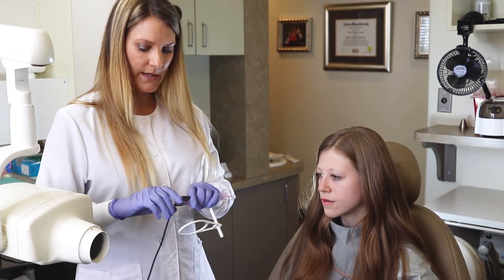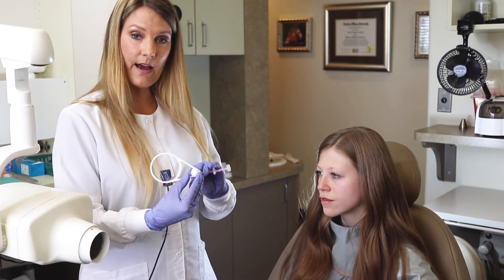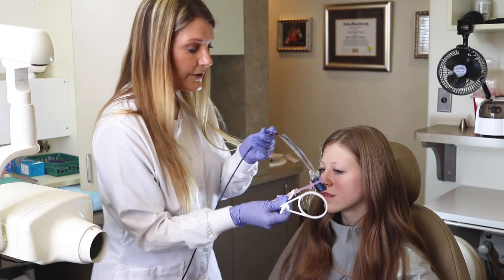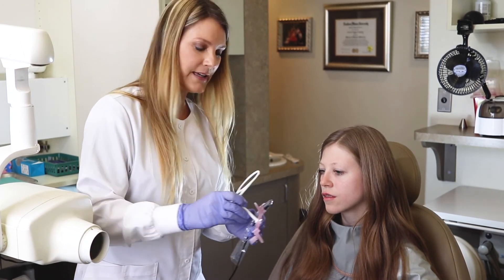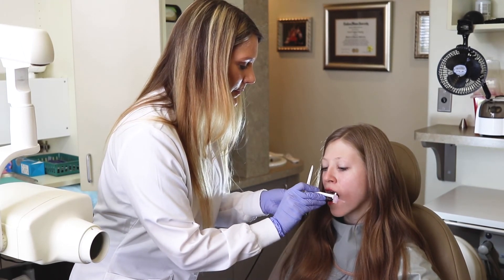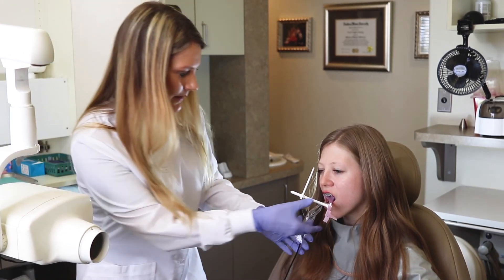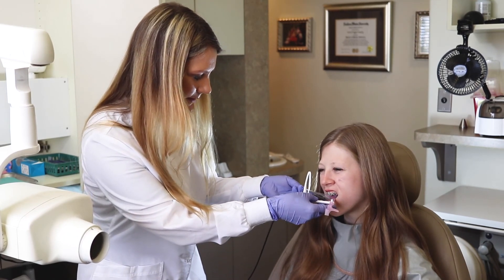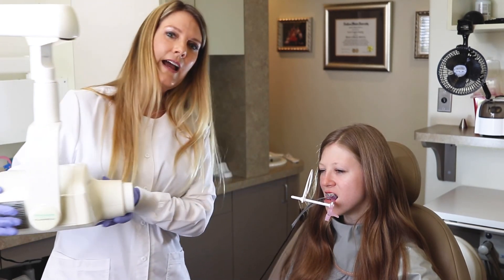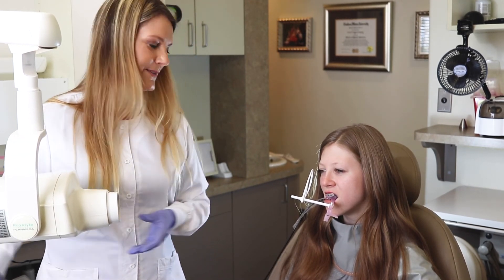From here, we're going to end up sliding this all the way to the top position, and we're going to click our ring to the highest position. We'll take three anteriors — just one, two, three — flip it and do one, two, three. And that's how you place the ComfyRay XT Skinny with your Dentimax Dream Sensor for a full FMX.